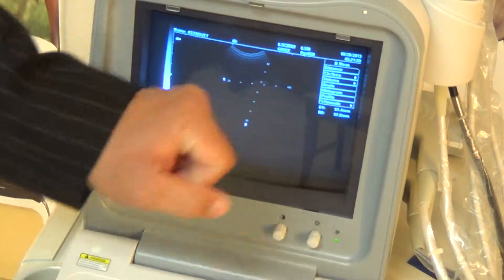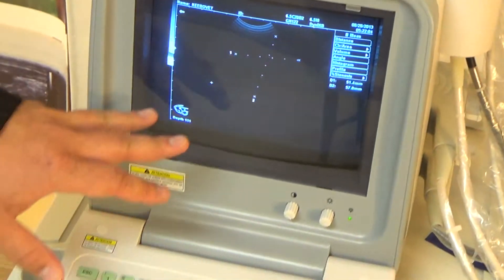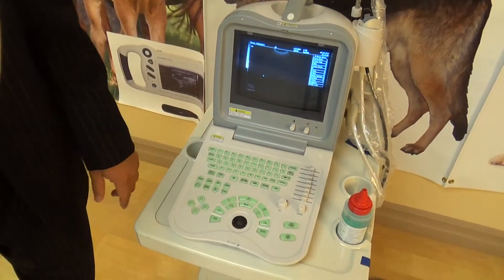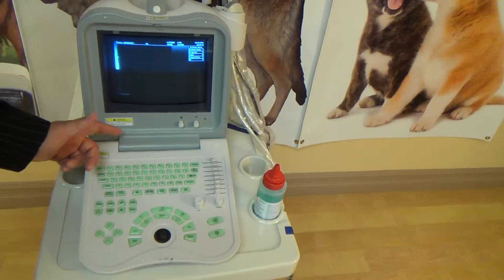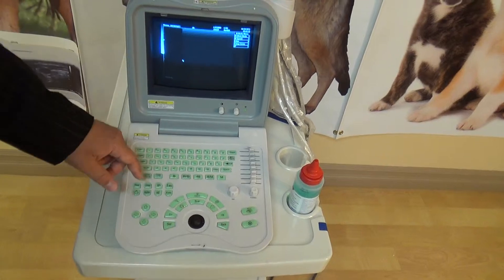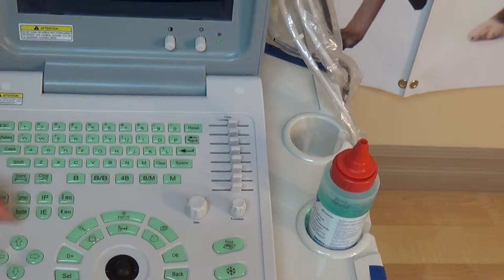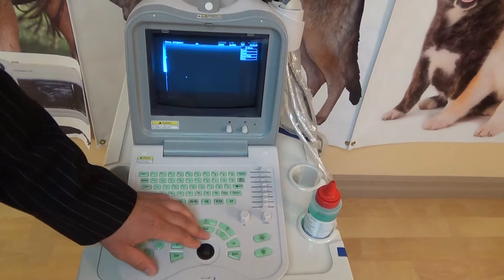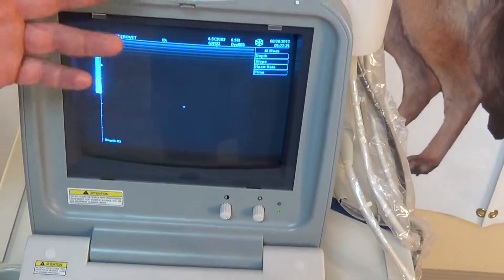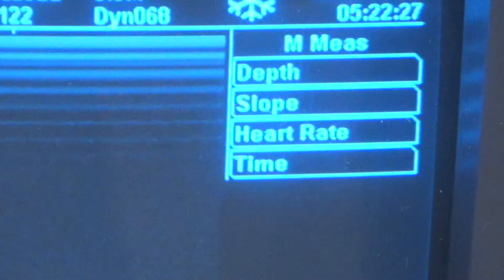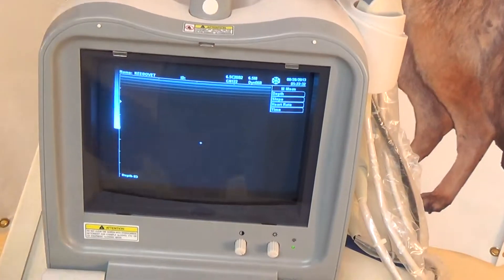That same measurement function is available in M-mode as well. M-mode would be used if you're measuring heart rate, for example. You freeze, hit your M-measurement button, and here you can select heart rate or time depending on what you're measuring — usually for cardiac settings. You can measure heartbeats and the amount of time it takes for valves to open and close. It's all kind of user-specific.